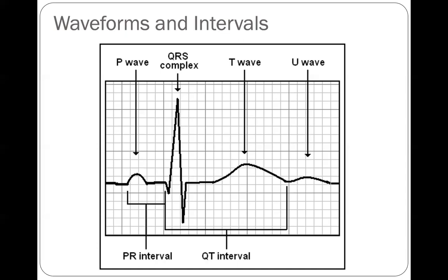How can we record an ECG? How can we use the cameras, which are the electrodes, in order to obtain the leads, the ECG paper, the components of the image, and how can we anatomically divide the ECG panorama into segments in order to image the different walls of the heart. And at this level, you have mastered the most difficult part in all levels of ECG. Then you will enjoy analyzing and getting the best of knowledge of ECG.